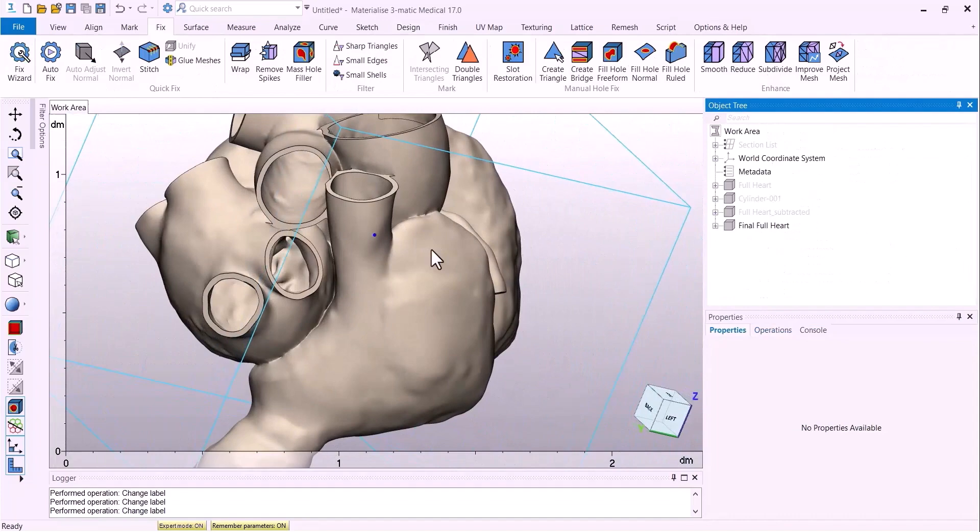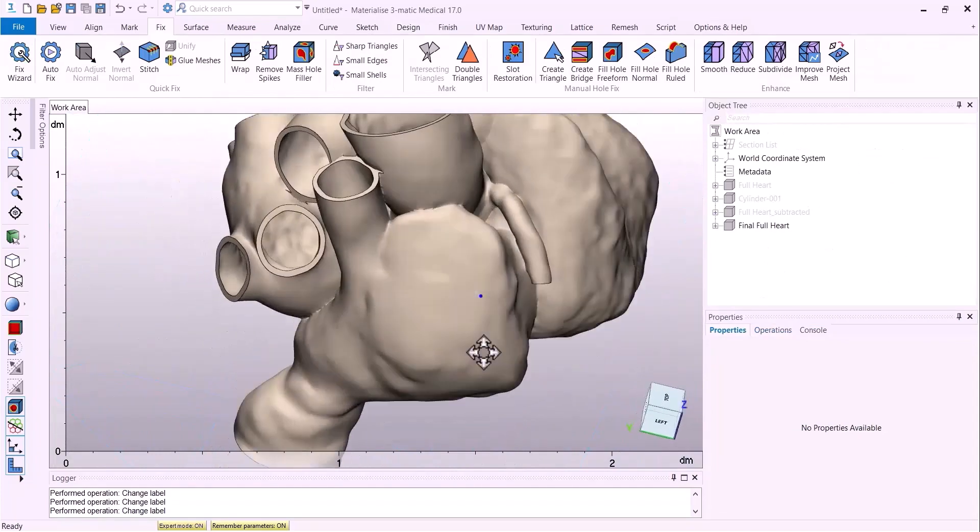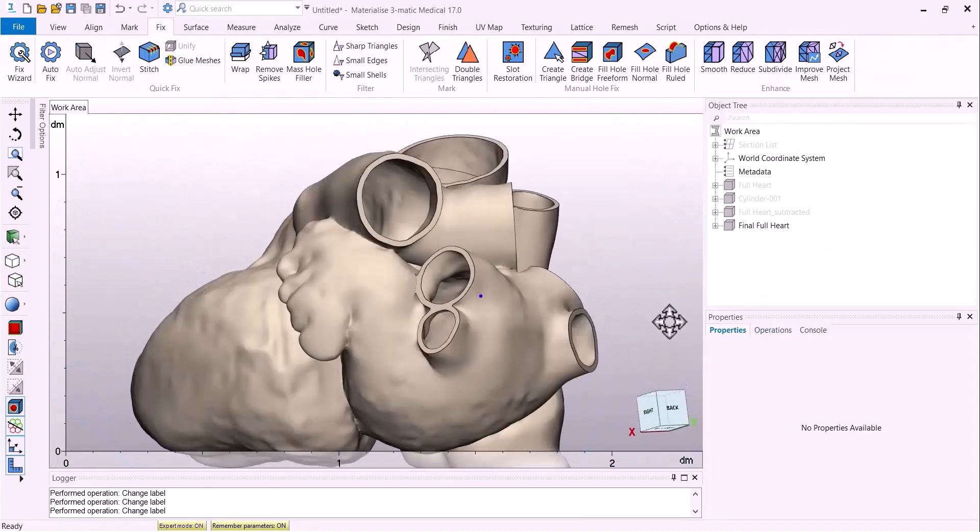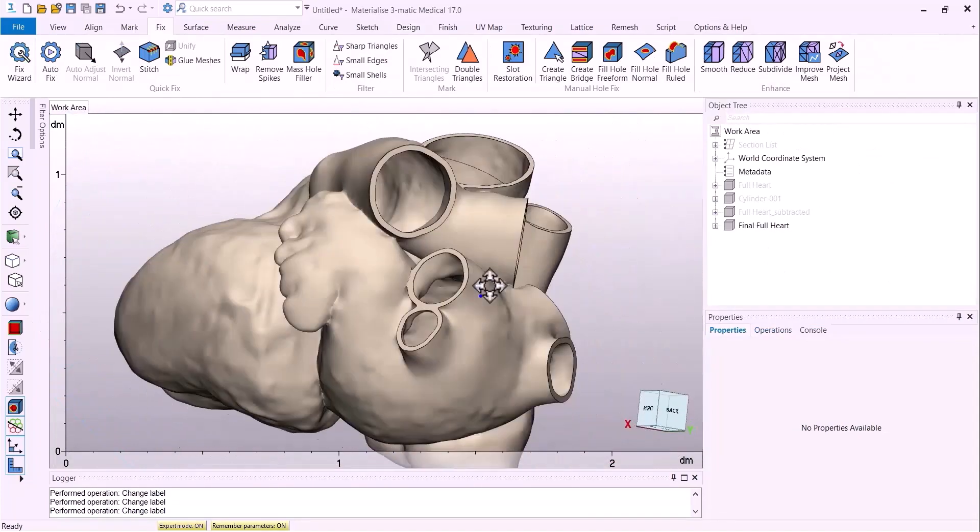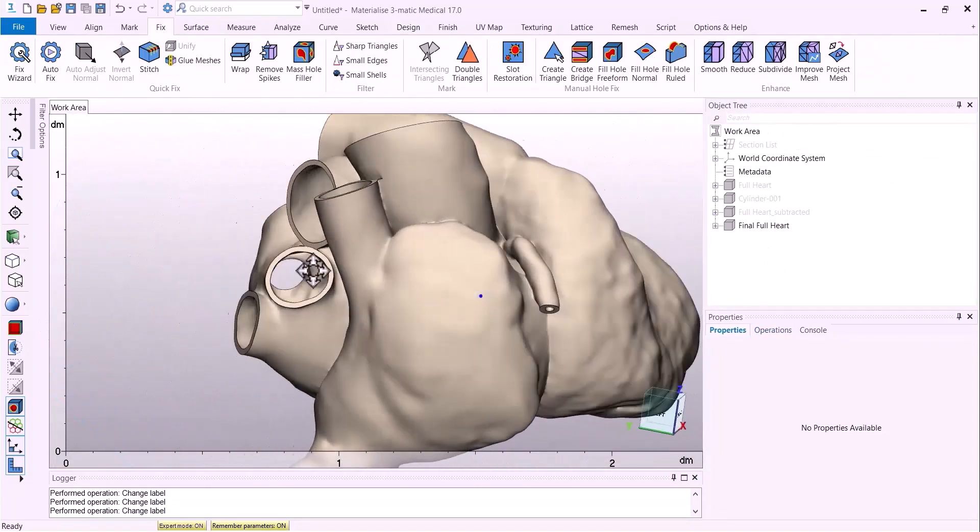With those methods, I'm able to perfectly cleanly cut all those vessels open.